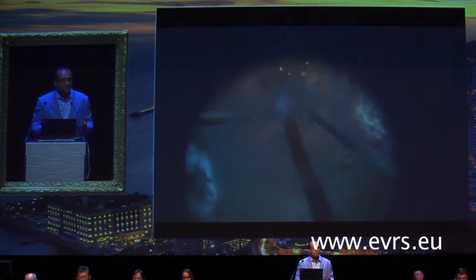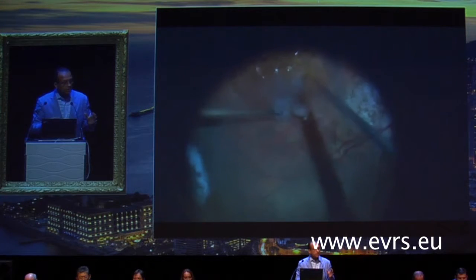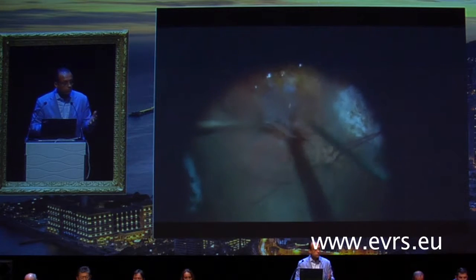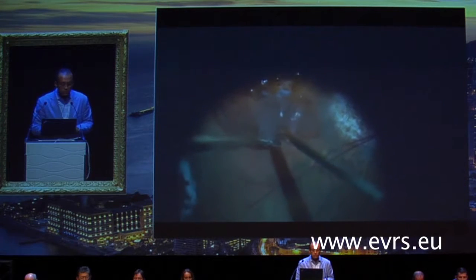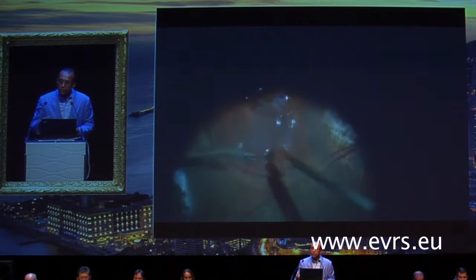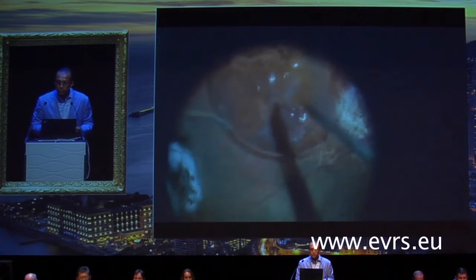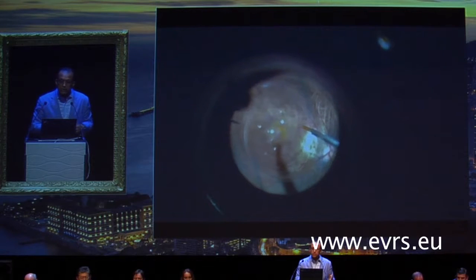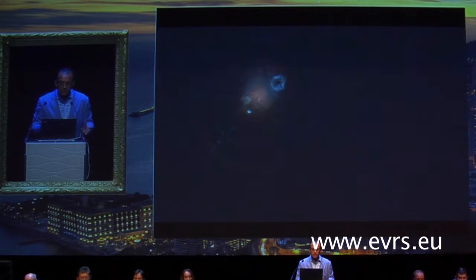It's very difficult sometimes in high myopia, and many of you have seen those cases, to know exactly the area of the hole, and sometimes a microscope OCT can really guide you. I use a swept source. I didn't use it initially on those cases, but as you do it, you take one of the forceps outside the eye and put the PFC with the double bore cannula that I use, and it stretches that transplant very nicely in the eye, over the area of the macular hole, and then I keep adding PFC.